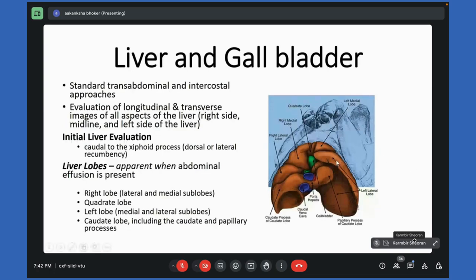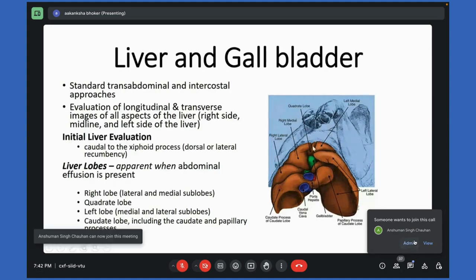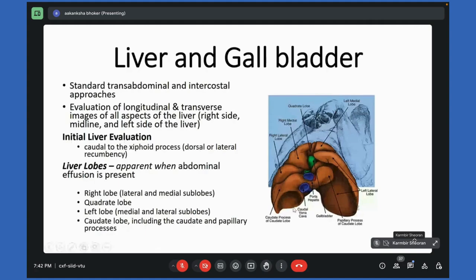As you all know, the liver has multiple lobes and sublobes. Here you can see this is the left area, this is the right side. On the left, there will be the left lateral and the left medial lobe. Then the quadrate lobe, and on the right side, the right medial lobe and the right lateral lobe. Caudally, most caudal is the caudate lobe, and this caudate lobe has the papillary process and the caudate process. Here it has a depression for the kidney, in which the right kidney is accommodated.